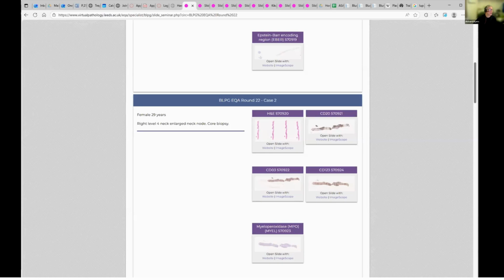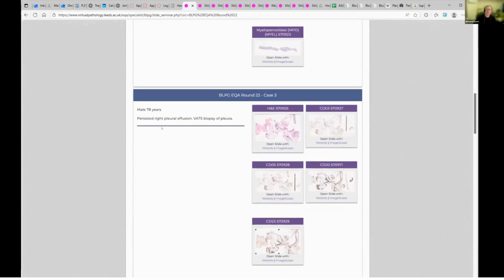Any other comments before I move on? Next case, a bit more straightforward. No? All happy? All not happy? Speak now and forever hold your peace. Okay. Right, we'll go on to case 3 then.